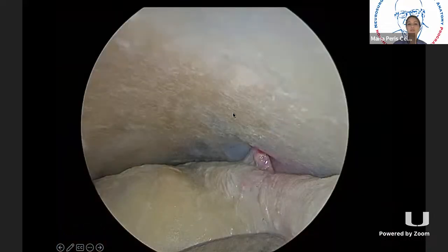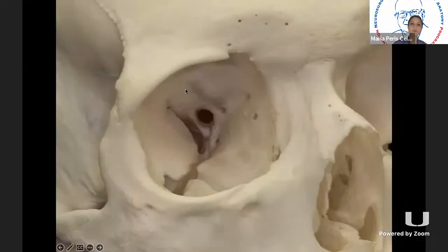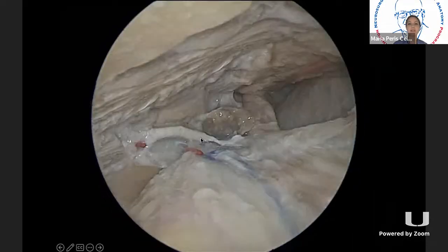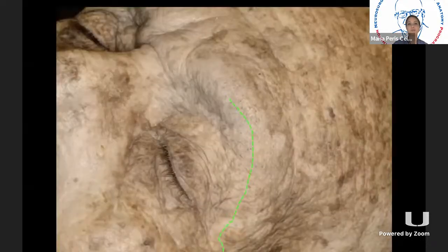And if we use the endoscope to look at this approach, this is the orbital roof, this is the periorbita, and we can see the anterior ethmoidal arteries. So we are right here looking at the right side of the orbit. And then we are going to see the superior orbital fissure. And this is the meningoorbital band, in continuation with the superior orbital fissure and the cavernous sinus. And we can even expose the optic nerve in the optic canal. We have here the frontal lobe, and we have here the superior orbital fissure and part of the anterior clinoid process. So we can go as far back, and this is all through the orbit, drilling the orbital roof.